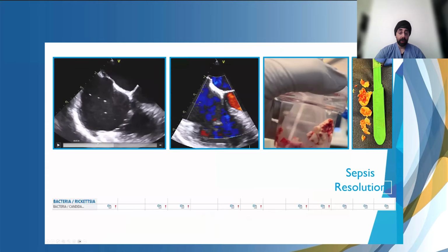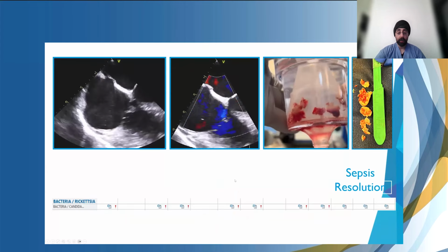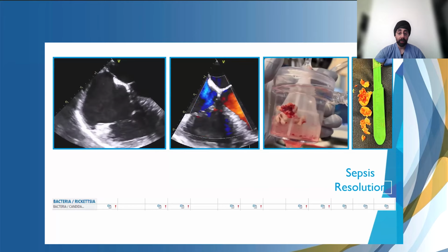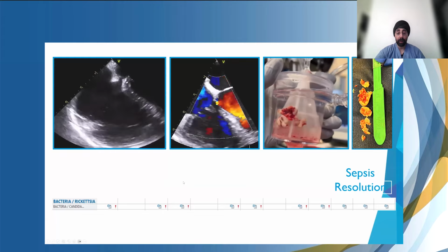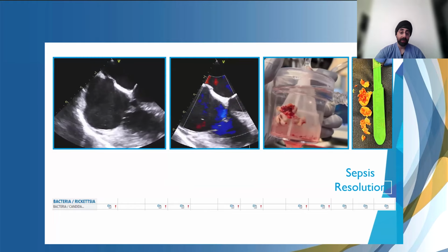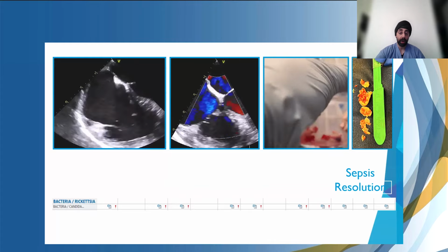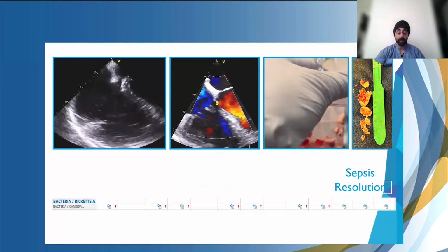This is another case example. In that patient, you can see successful removal of clot, and at the end what kind of material you get out. This is a very common haul, so to speak. Make sure you send this to microbiology so we can make decisions about antibiotic management. You'll be surprised that sometimes not all of the bacteria or other pathogens present in the bloodstream in the bacteremia are identified, so from the material you may get an additional microbe or source that helps you tailor your antibiotics more effectively. Then hopefully you'll get sepsis resolution afterwards, and we see that quite commonly.